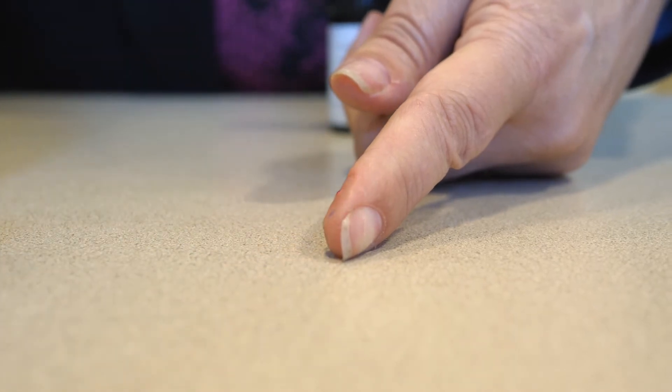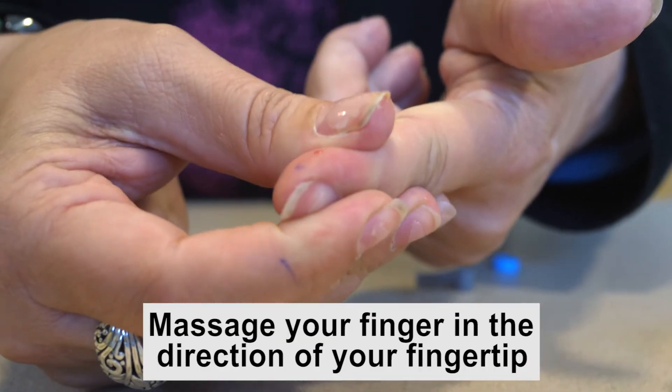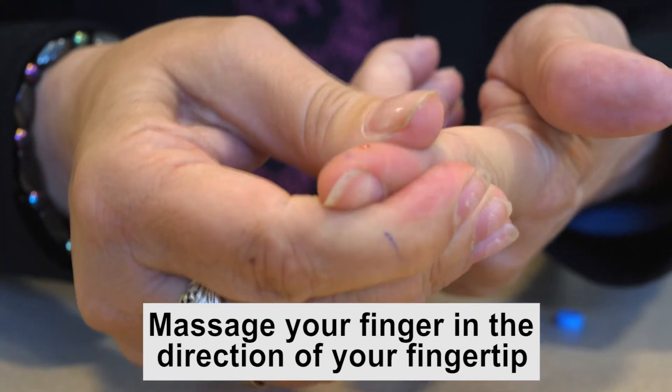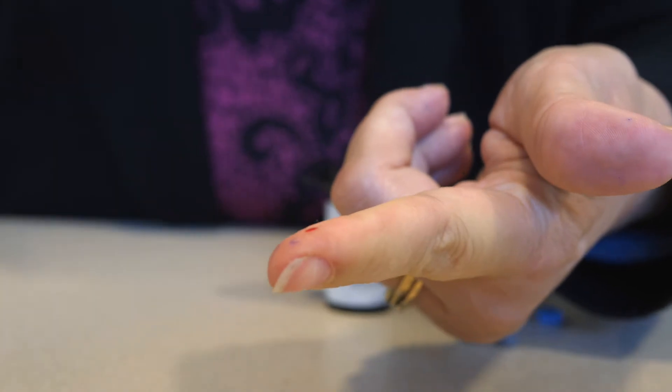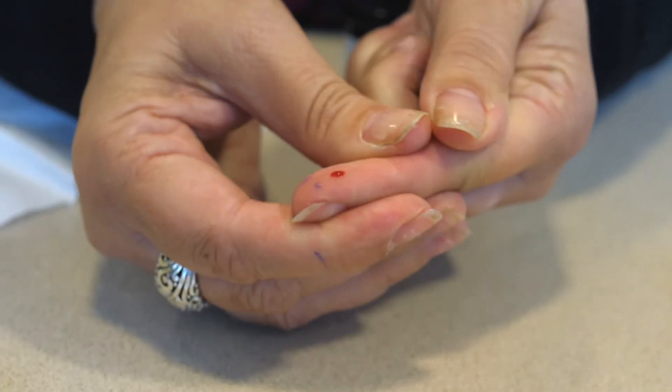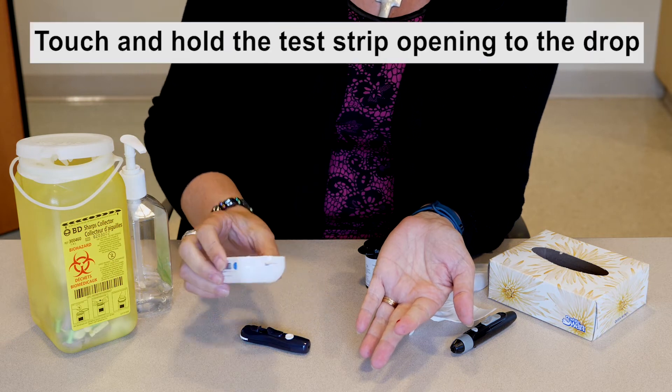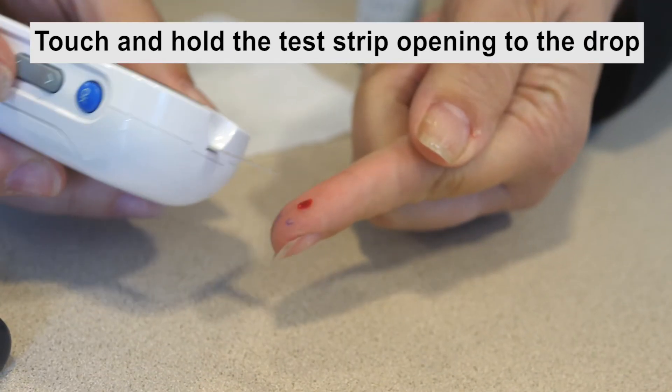You may want to stabilize your hand by placing it on a flat surface. Gently massage your finger in the direction of your fingertip until a round drop of blood appears. If the blood smears or runs, do not use the sample — instead, dry the area and gently squeeze for another drop of blood.